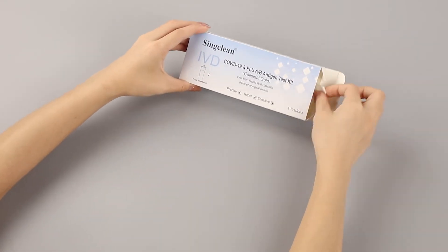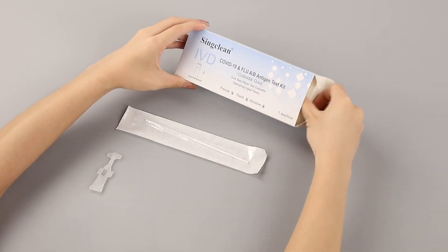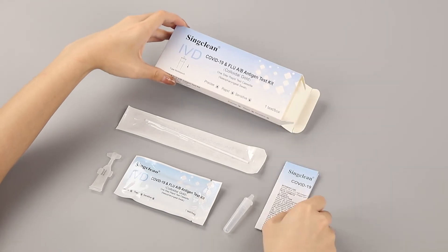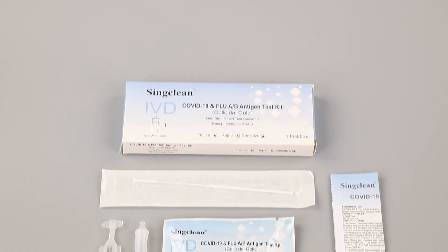Take a one test per box as an example. The kit includes sampling cotton swabs, test card, antigen extraction buffer, tube, paper workbench, and instruction for use. The results are available in 15 minutes.